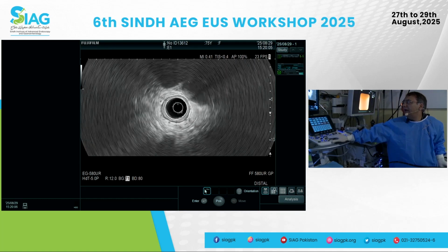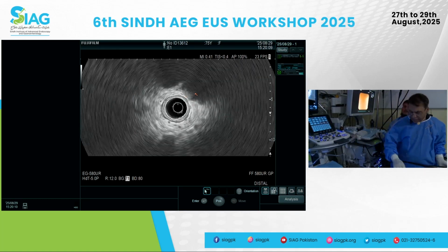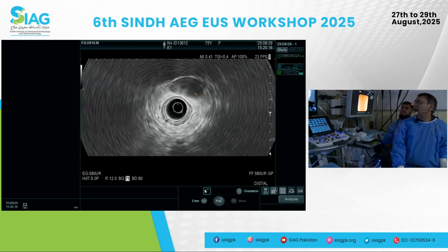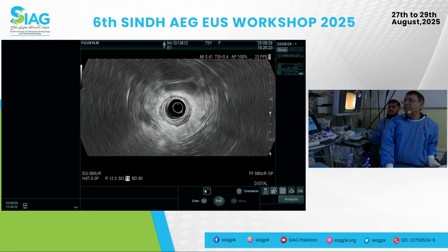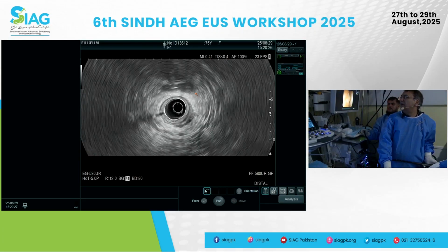Here we see the bladder, and in this case, this looks more like a cervix or uterus, but I'll pull that a little bit back to get an idea. This looks more like a cervix because it's a solid organ, you can see. Then as I start coming back, it's going to disappear, and you will see some air there.